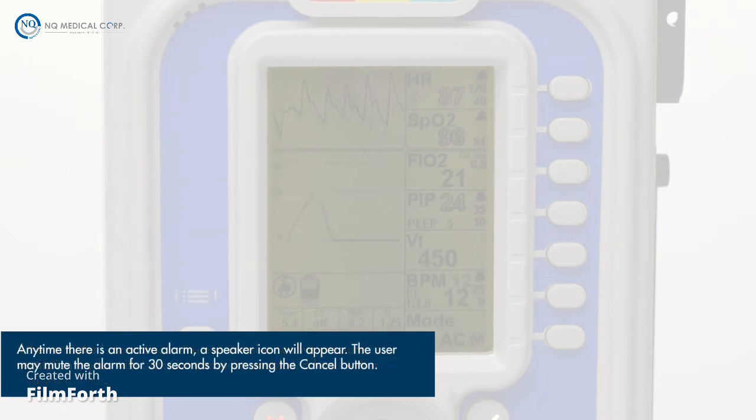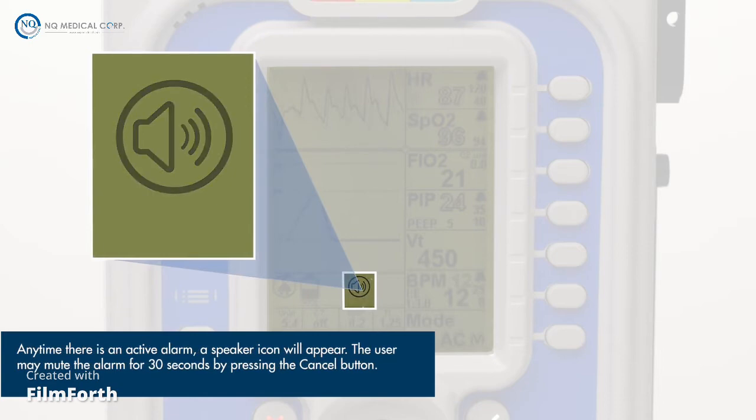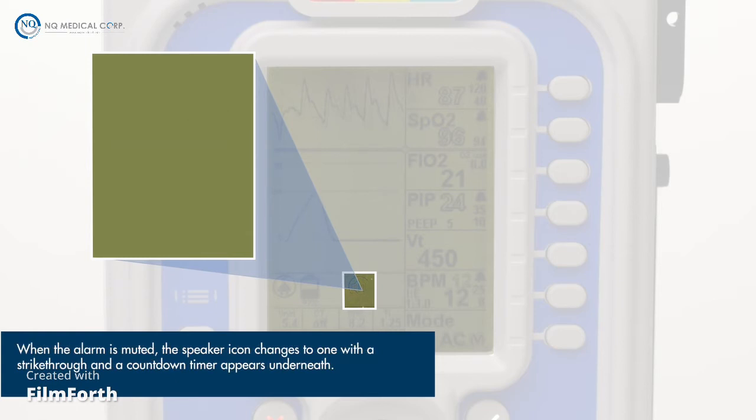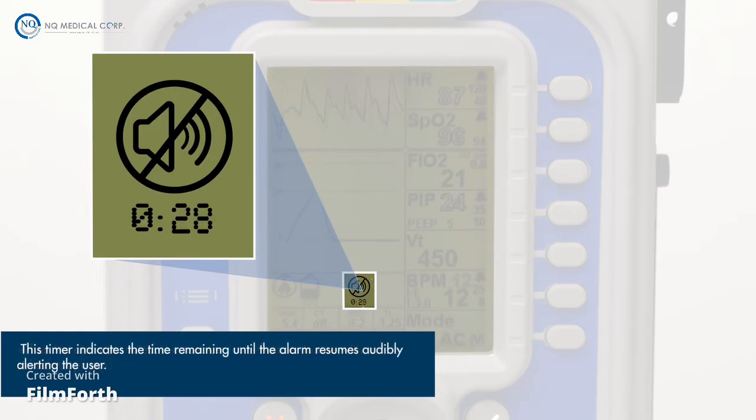Anytime there is an active alarm, a speaker icon will appear. The user may mute the alarm for 30 seconds by pressing the Cancel button. When the alarm is muted, the speaker icon changes to one with a strike-through and a countdown timer appears underneath. This timer indicates the time remaining until the alarm resumes audibly alerting the user.